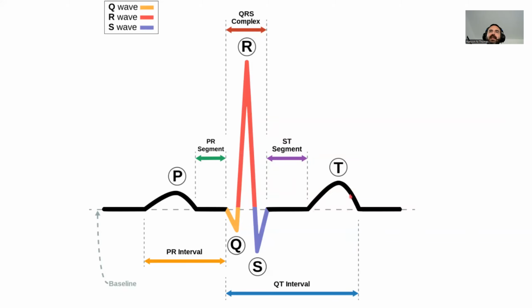And then this last one is the T wave. The T wave is the heart repolarizing itself. The way to think about this is the heart is basically an organ that's just a bunch of muscles pumping blood. So this is the brain telling the muscles, hey, let's go do the deadlift we're about to do. This is doing the deadlift, right? It's a lot of work. And then this T wave is like, you drop the weights on the ground and you go, whew, I don't want to do that again. Except then, in another second or two, you're going to have to do it again, 100 times a minute for the rest of your life. But that's kind of what's happening here, right?